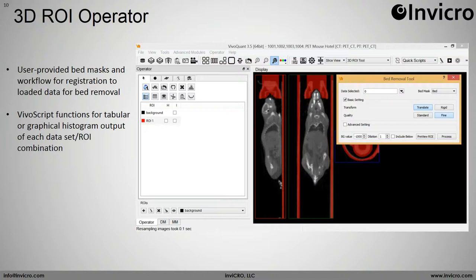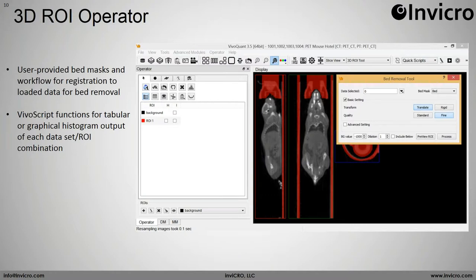Another critically important tool is the 3D ROI tool. The big addition here is bed removal — a lot of users have asked for improvements on our bed removal tool for the last couple of years. Historically we had a very fixed bed removal tool, but now we've added the ability for the user to drive their own bed removal template: provide an ROI of what the bed looks like in one dataset, and apply that ROI for subsequent bed removal in other datasets. We've also added VivoScript functions to streamline histogram analysis of individual ROIs.